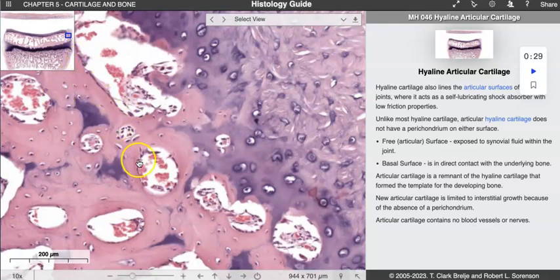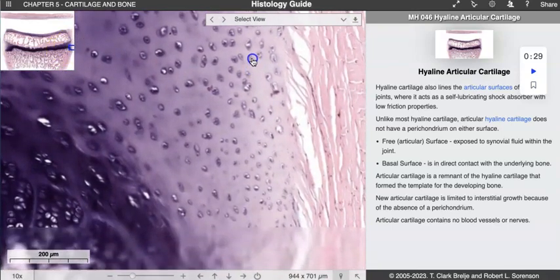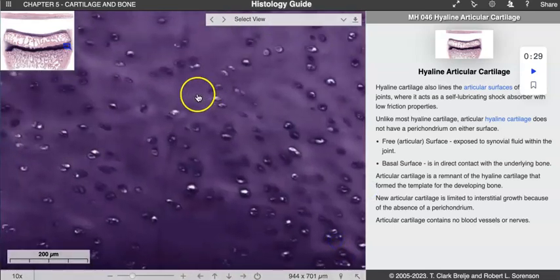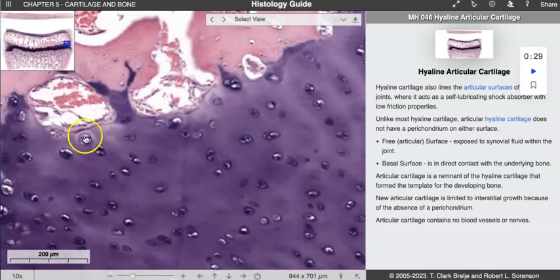Trying to think of any other area. Maybe I can jump down there. And even a lot of those look like chondrocytes too, right? And then we get more into our fibroblasts over here on the side. So the growth plate area, which I want to stay away from, you can possibly see some chondroblasts up in this area.